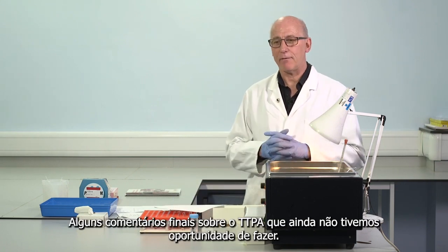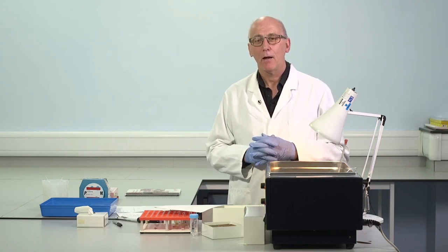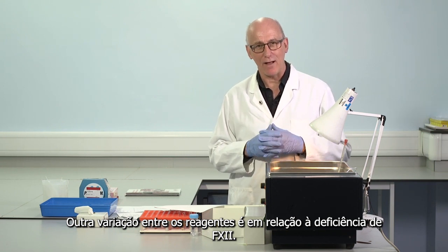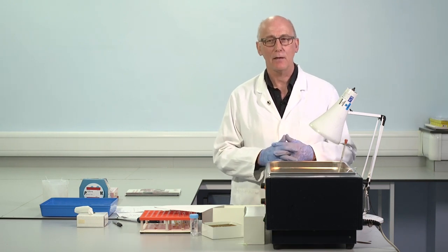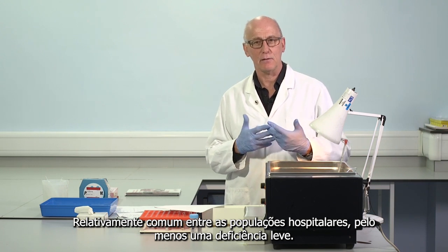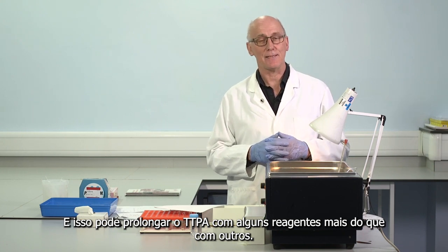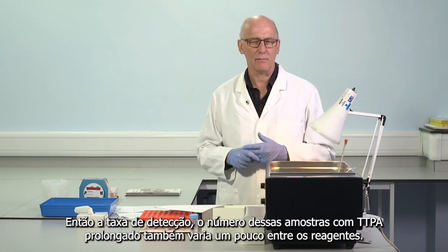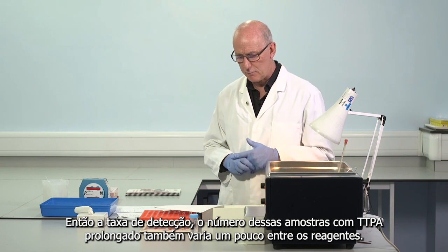A few final comments about APTT that we did not yet get a chance to make. Another variation between reagents is in relation to factor 12 deficiency. Factor 12 deficiency not associated with bleeding, relatively common amongst hospital populations, at least mild deficiency. And this can prolong the APTT with some reagents, more than with others. So the detection rate or the number of such samples with prolonged APTT, that also varies a little bit between reagents.